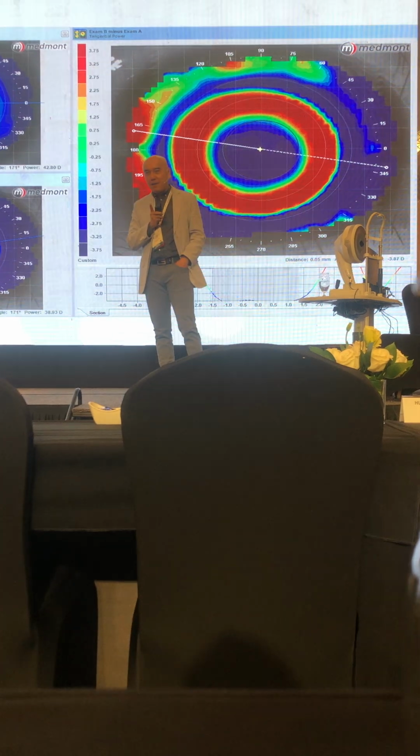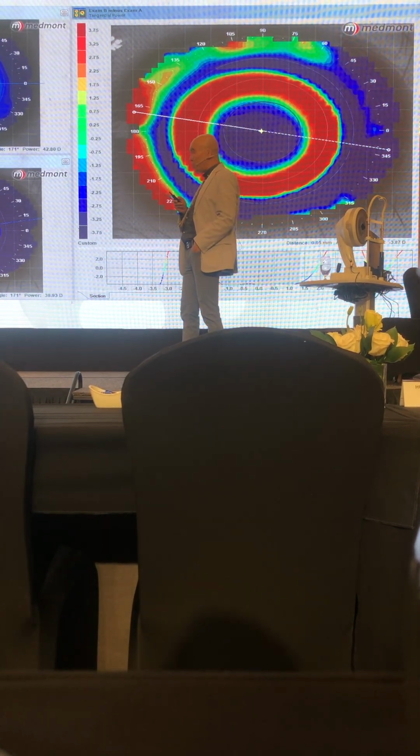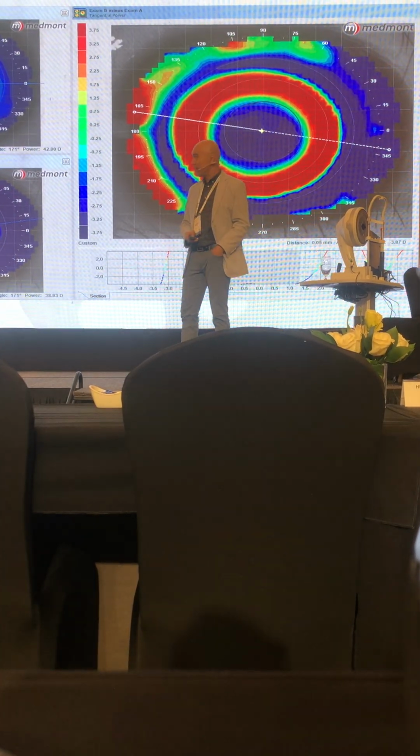Yes. So in future myopia management, you want to know whether your Ortho K lenses have created enough peripheral defocus. You are going to refer to this. And this is a different spec as well.